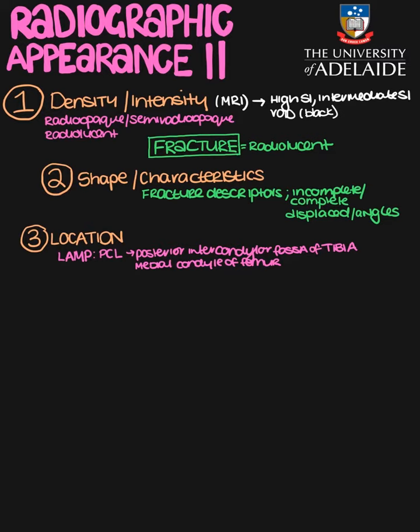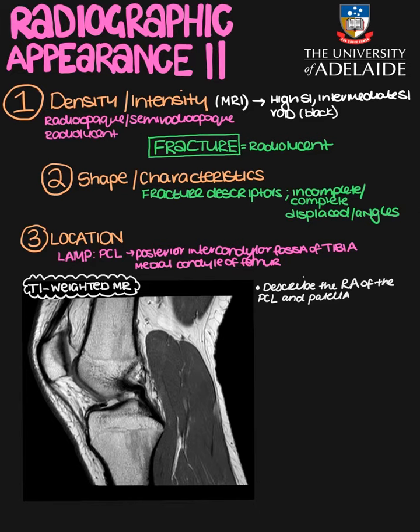I'm now going to pull up a couple of CT and MRI scans to practice describing the radiographic appearance of normal anatomy structures as well as some fractures. I've brought up a T1 weighted MRI of the knee. If I ask you to describe the radiographic appearance of the posterior cruciate ligament and the patella, I'll work through what I would expect as a master answer.